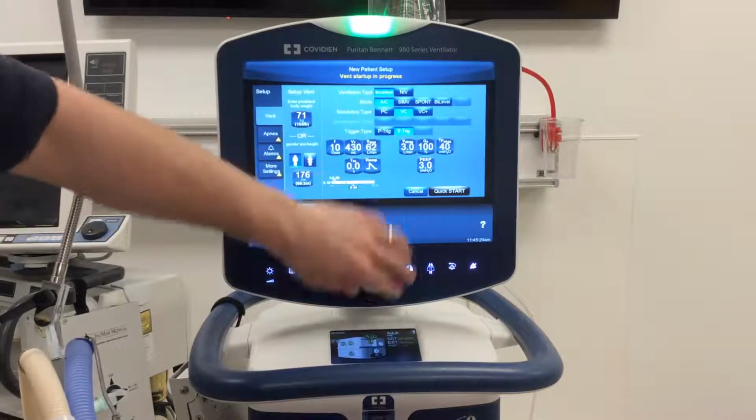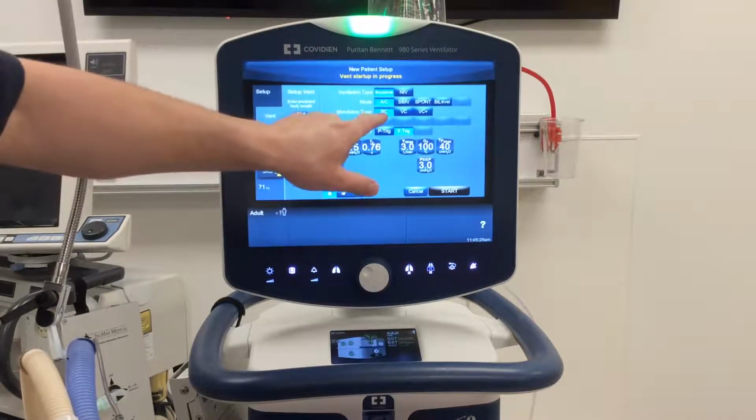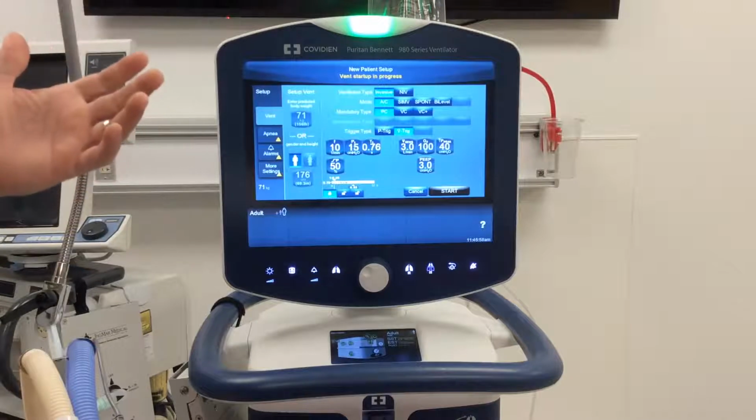If you wanted to change some of this, if you hit pressure control, instead of guaranteeing a certain size breath every single time, we can control the amount of airway pressure that is attained at the proximal airway. Right there at the patient's ET tube, or the Y, we could choose to deliver a consistent and constant amount of pressure to the patient's airway and hopefully give that pressure and volume delivery down into the lungs. There are benefits of pressure ventilation, but there are also some negative aspects of pressure ventilation.